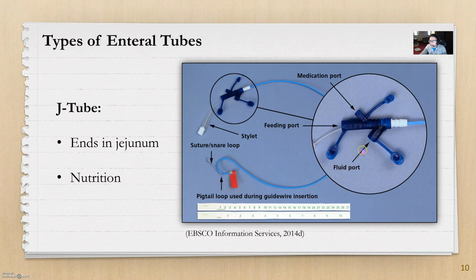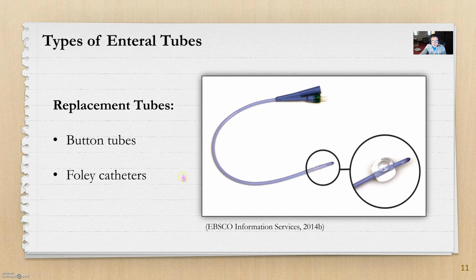You notice it's got all these little ports down here too. It's got a medication port, a feeding port, and a fluid port. A lot of people disconnect and just push through here because of the size of it, but I encourage when you can just push through the medication port to prevent them from hooking and unhooking as much as you can. It prevents infection.